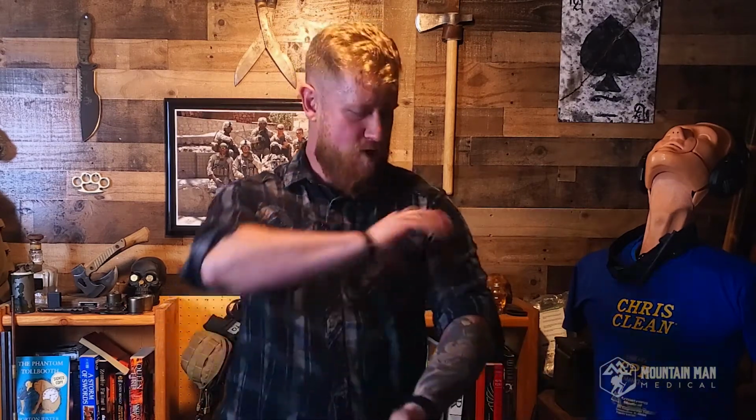Now, the other thing that I really like about this ratcheting system is that it's not a windlass. The windlass, like on a CAT tourniquet or a SOF-T Wide, works just fine, but I have had situations where I've been trying to tighten it down and my hands have slipped off and then it's just unraveled completely, and then I've just got to retighten it down. Not a huge deal, but it is annoying and frustrating, especially when you're under time constraints, like someone is bleeding out. You know, it doesn't add a whole lot of extra time. You just tighten it all down again and it's good to go. But at the same time, with a ratcheting system like this, you're not going to have to worry about that at all. Once you put a click in it, that click's not going anywhere. So I think that's an added benefit of this ratcheting system.